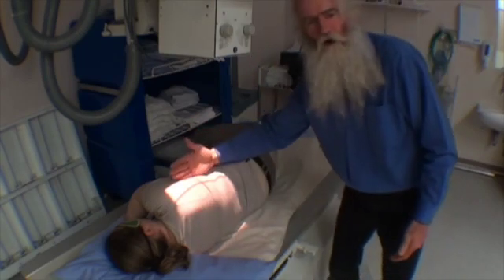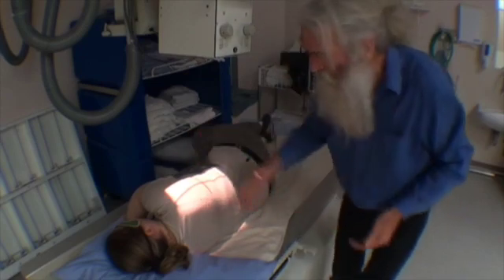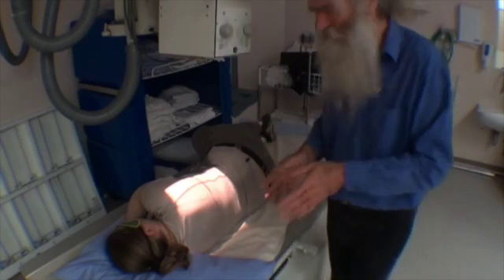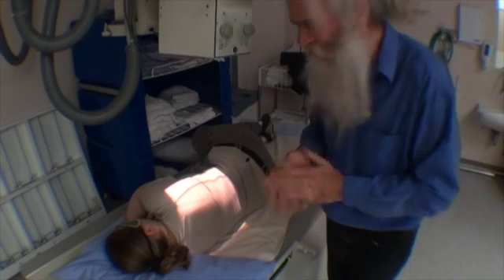I haven't gone halfway across to the chest. I'm making sure that we're nowhere near the front part of the chest. We haven't included the thyroid, we haven't included the sternum. There are lots of really serious things that go wrong when people really don't understand collimation and accuracy within radiography.